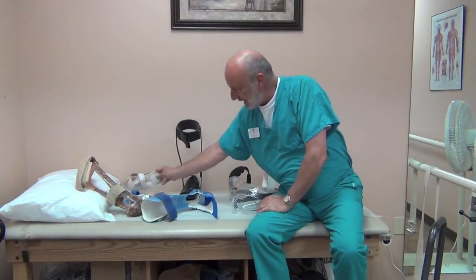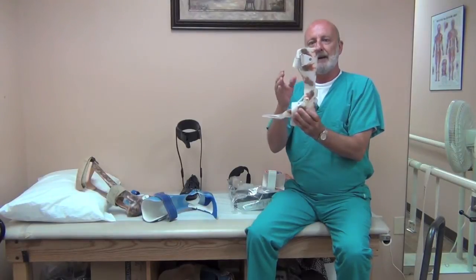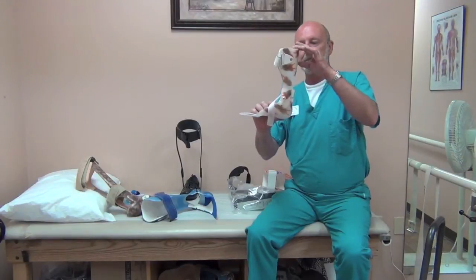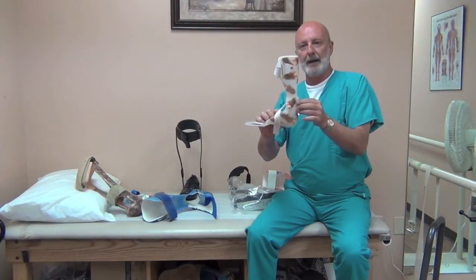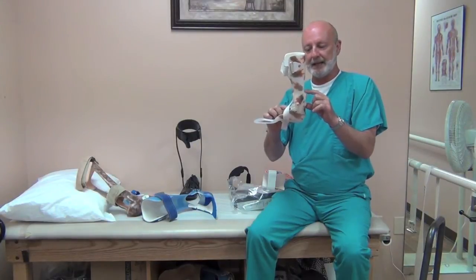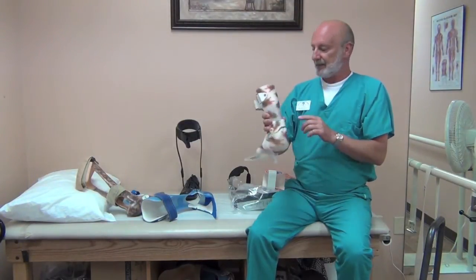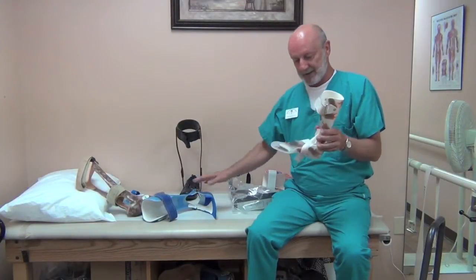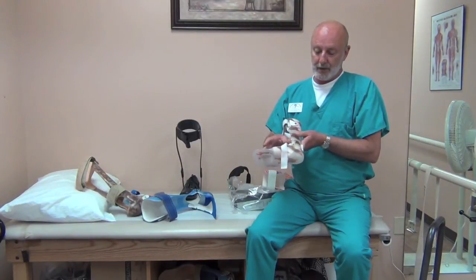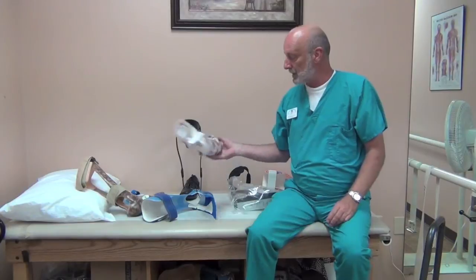Sometimes there's a need to add a bumper in the back — if you have a hyperextension issue at the knee, then you might want to incorporate a plantar flexion stop. Typically this isn't added unless necessary, but it is a variation of this design. This one can be made with the spring assist joints, or just straight joints, because the bumper will maintain 90 degrees going through.